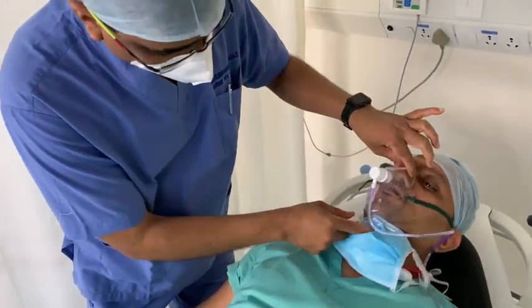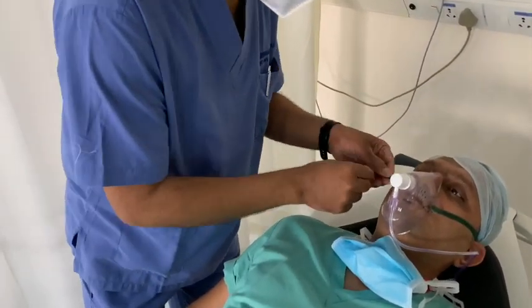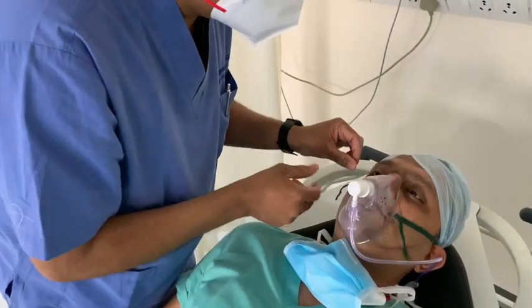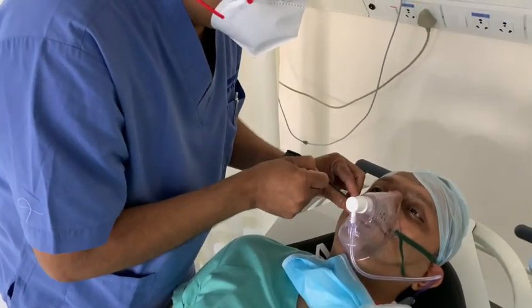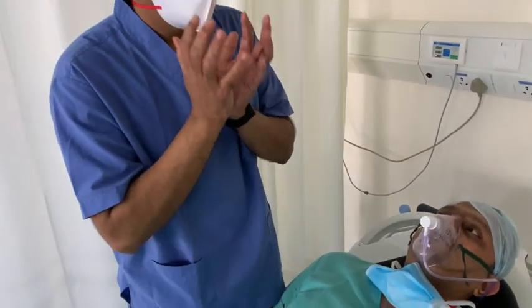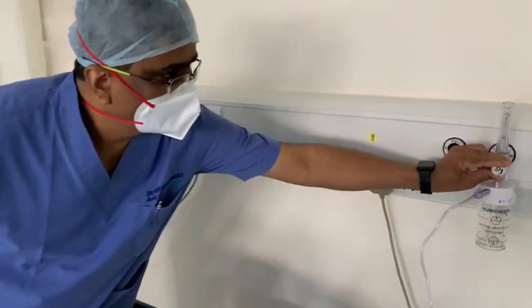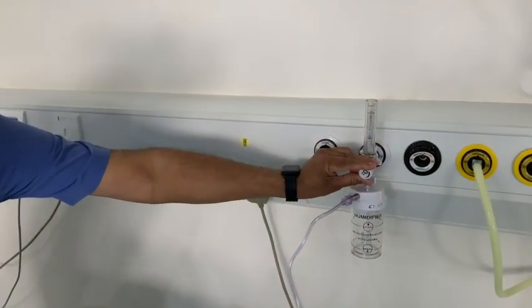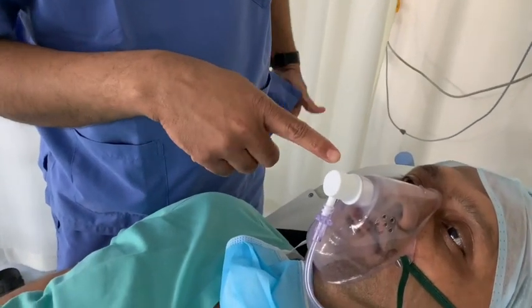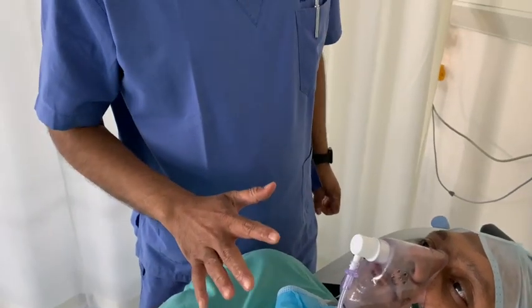To use it, put it on the face with the nasal bridge in place and it should fit below the jaw. Put the strap above the ears and gently tighten it. The entire mask acts as a small compartment where oxygen collects. Once we start the oxygen, you can see some humidity coming from the patient.